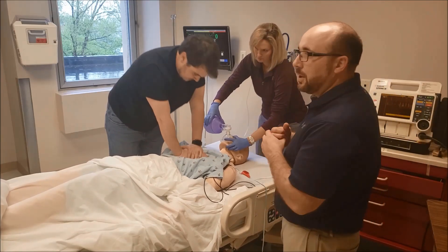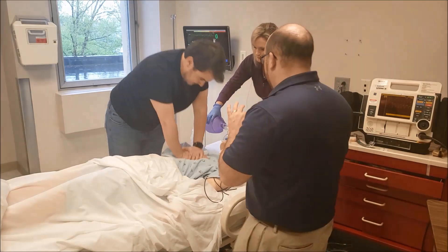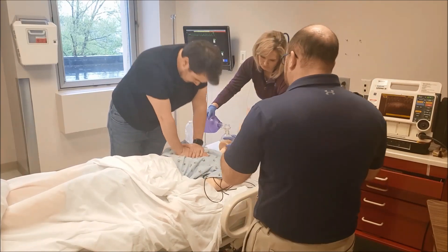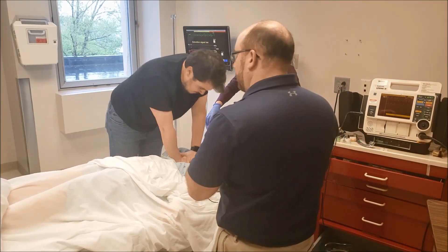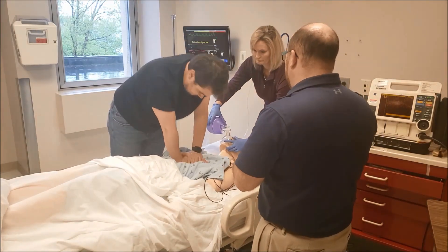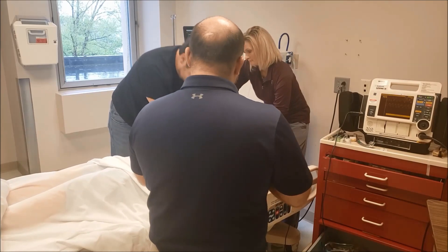During this two minutes of CPR we're going to look at our other H's. Hypovolemia — fluids are wide open. Hypoglycemia is a really common cause in the hospital, so we'll get a quick finger stick blood sugar. We'll also look at our T's: tension pneumothorax — do we have adequate bilateral chest rise with ventilation? Yes, bilateral chest rise. If we suspect toxins, trauma, cardiac tamponade — and thrombus, which is kind of what we're thinking because this gentleman came in with chest pain.